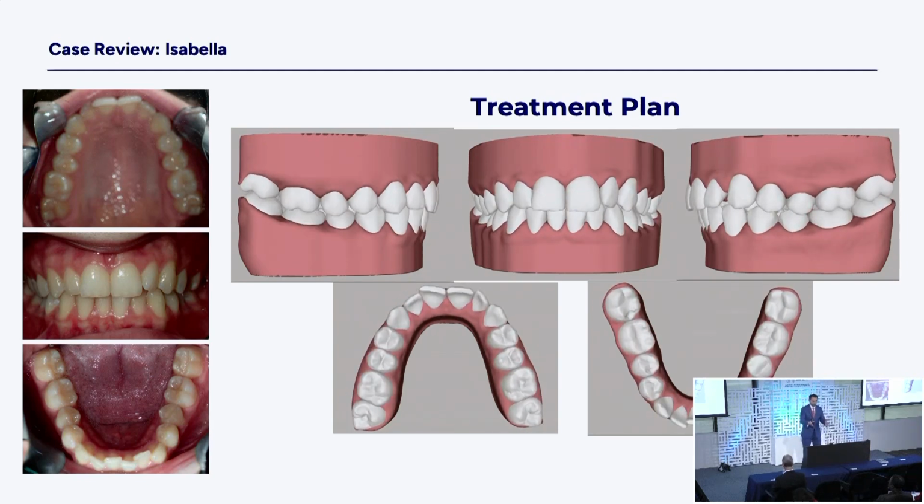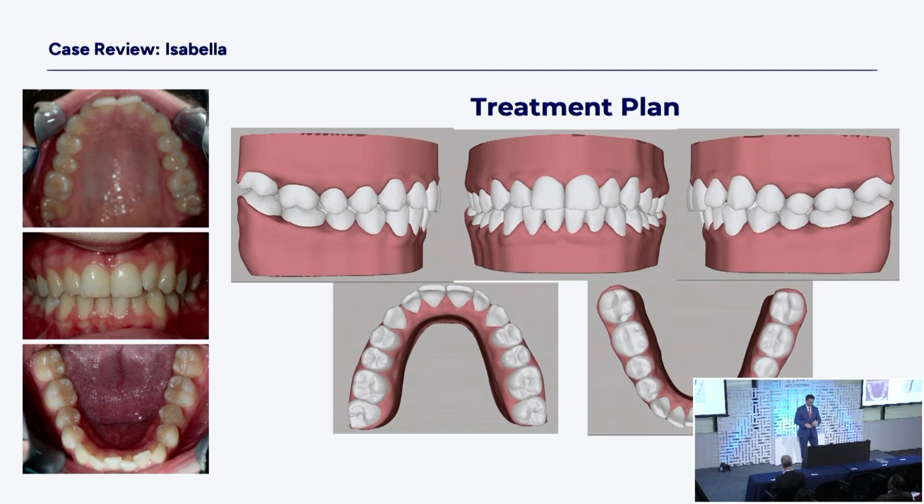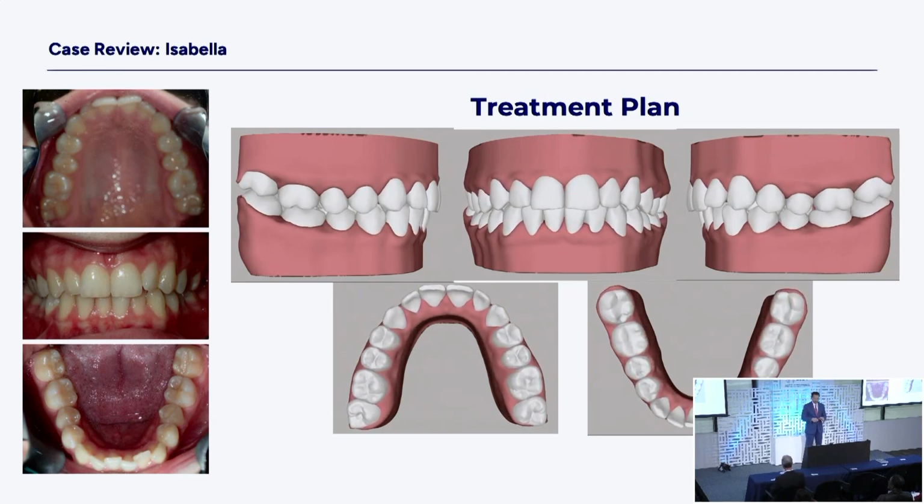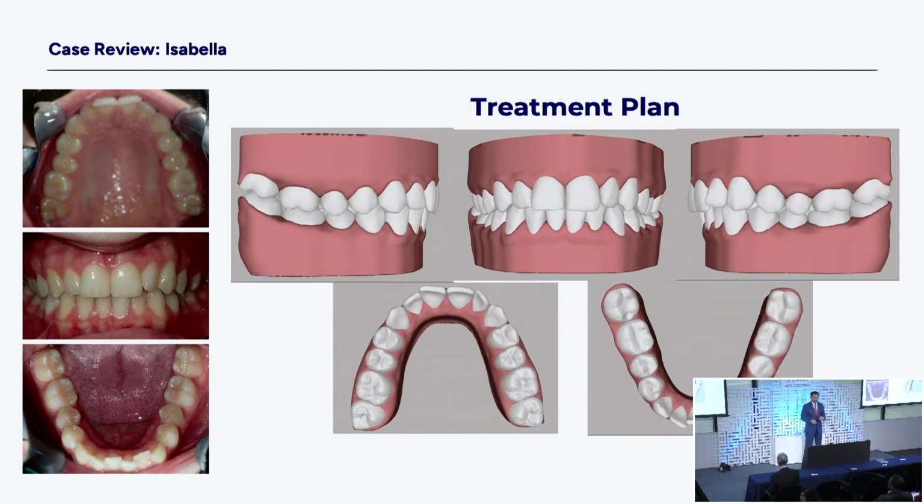The lower teeth, back teeth wider, front teeth forward. Very smooth, right? Back teeth wider, front teeth forward. It's very easy, simple formula. Now we're going to move these teeth.